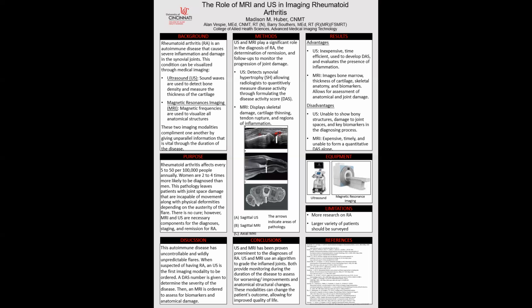Both imaging modalities provide monitoring during the duration of the disease to assess for worsening and/or improvements to the anatomical surrounding structures, while also assessing for structural changes to the anatomy. These imaging modalities are both working together to improve the quality of life for each rheumatoid arthritis patient.